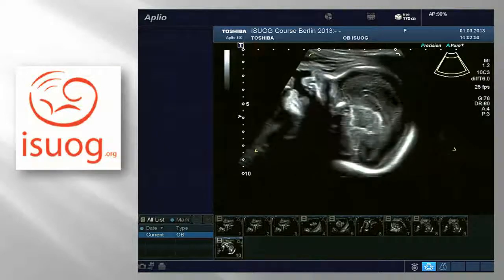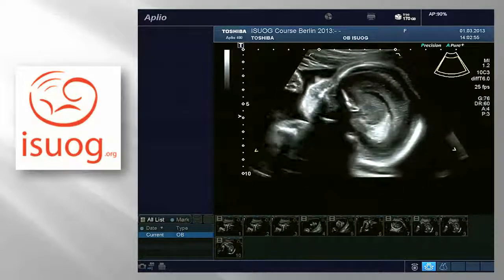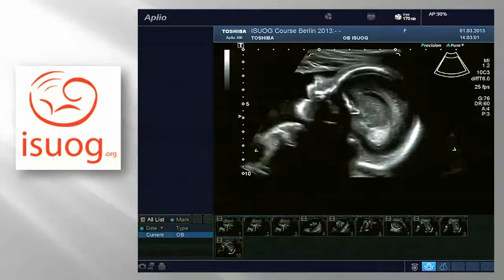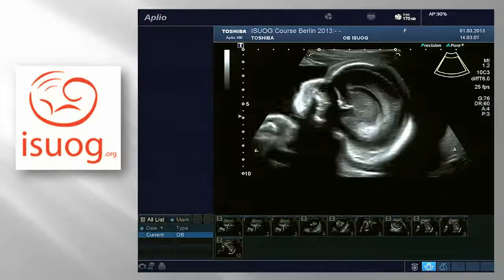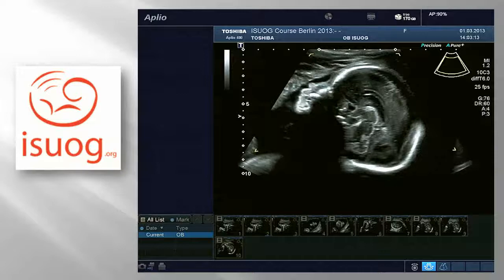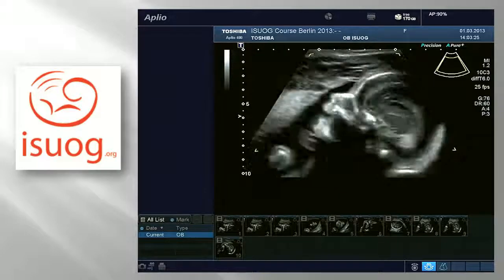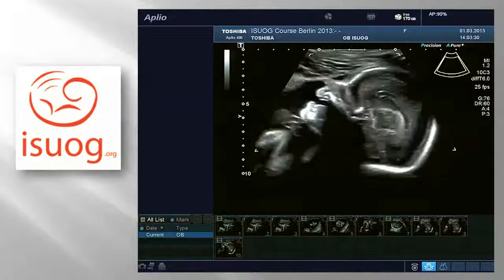Lot of activity going on. Even if you are not doing a vaginal scan, as you can see, with some very mild manipulation, believe me, it is very mild, you can see very well the cavity of the lateral ventricles, the choroid plexus, the midline structure, and, okay, can you freeze the image right here? Even the cavity of the fourth ventricle, most likely. It is a little bit difficult to be completely sure that we are exactly on the mid-sagittal plane, and that is really the cerebellar vermis.